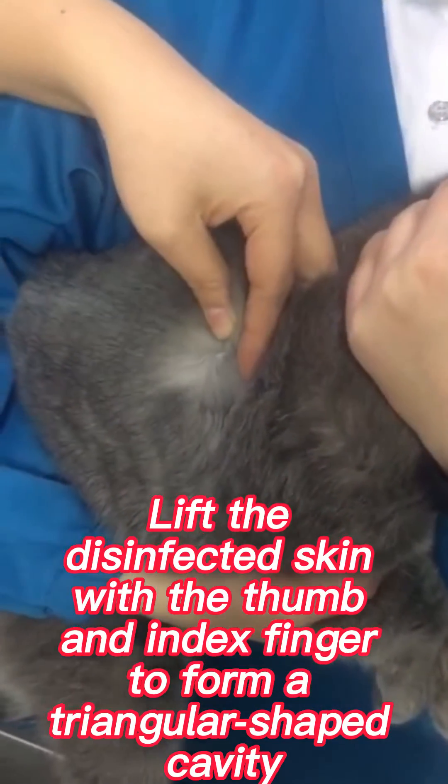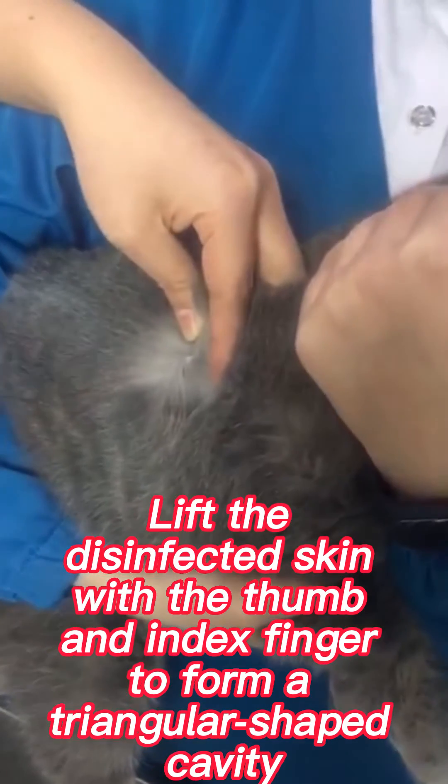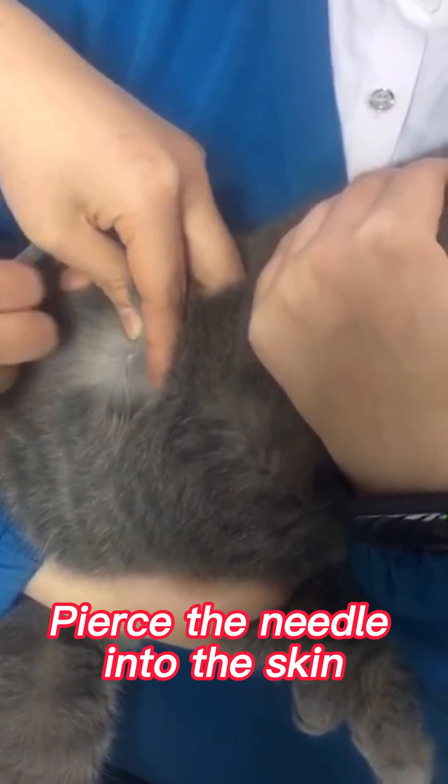Lift the disinfected skin with the thumb and index finger to form a triangular-shaped cavity. Push the needle into the skin.